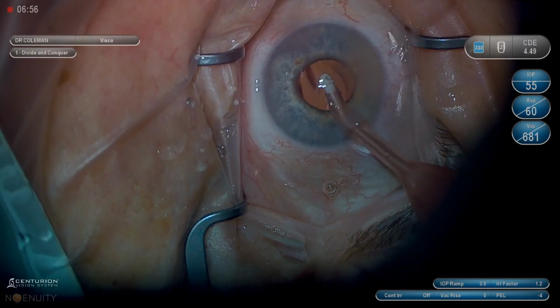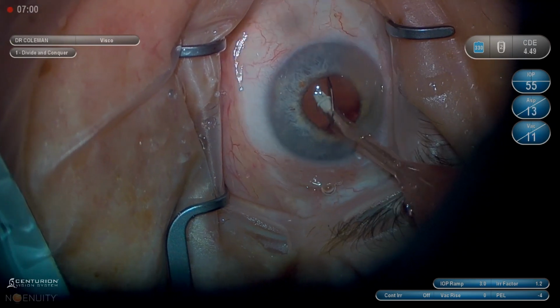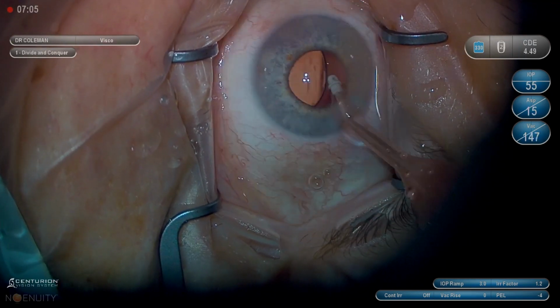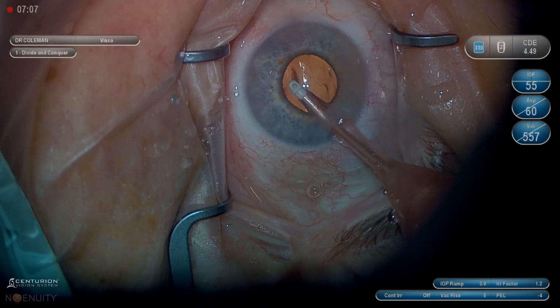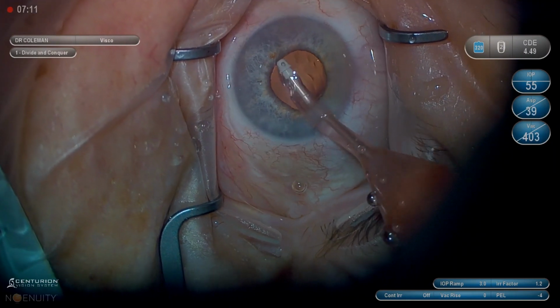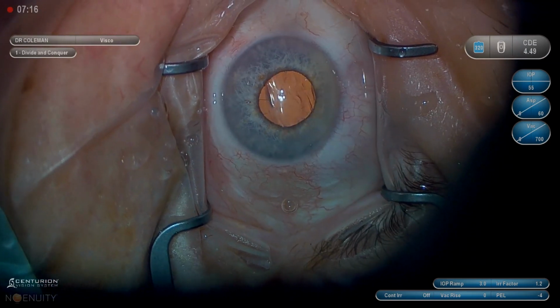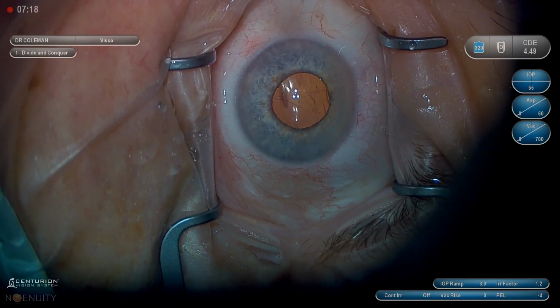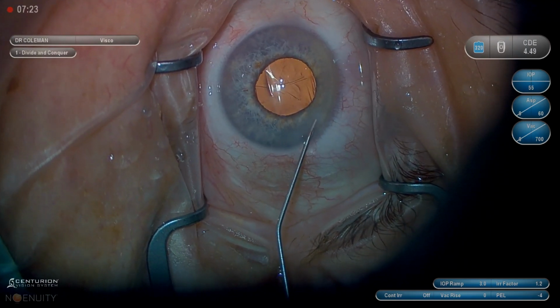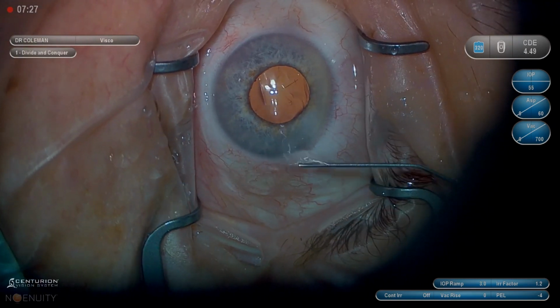The theory that you need to go bevel up comes from the idea that you're going to nick the endothelium by going bevel down. I'm not sure that's really true. I think the nicking of the endothelium occurs with the phaco tip, and I'm more careful to insert it with some down trajectory to not nick the endothelium and dislodge some of it there. So I think bevel up, bevel down is fine. I think stabilizing in the para is fine, but I do not think it is necessary. I generally prefer my technique.